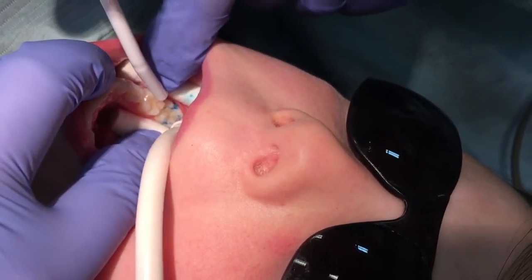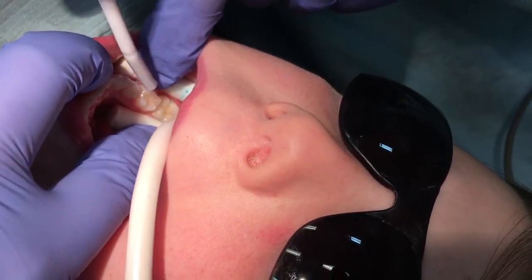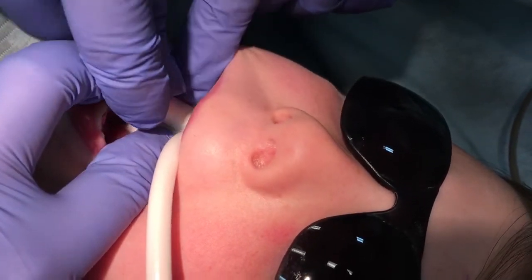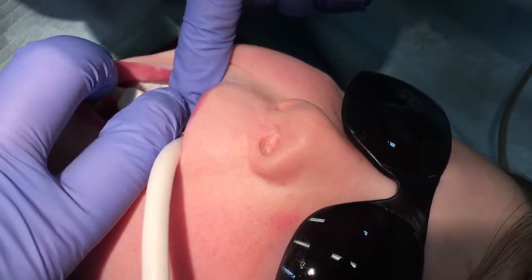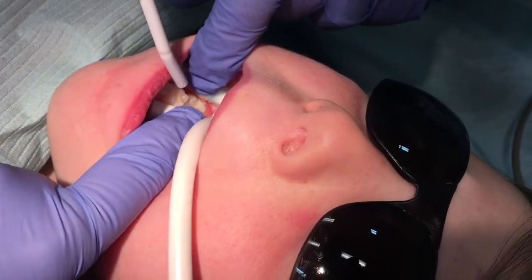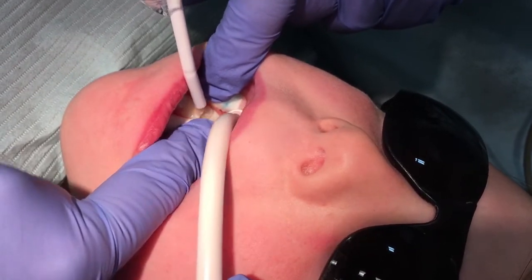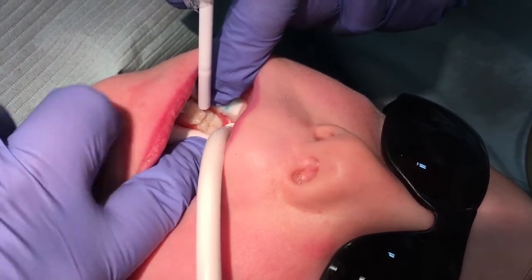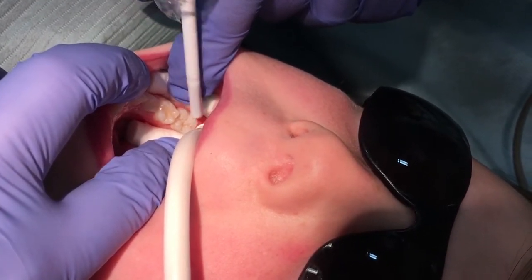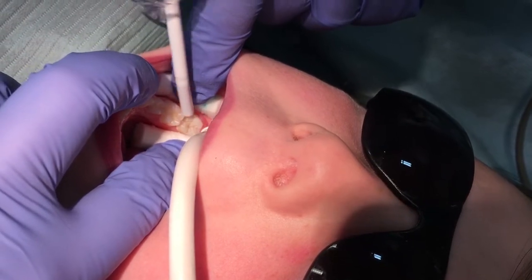Rinse off the etchant thoroughly. Remove excess water, then re-isolate. You can do this by either adding a cotton roll, if that's comfortable for your patient, or you can add a cotton roll and then use forceps to slip out the old, wet cotton roll from underneath. Do not allow saliva contamination when re-isolating. When the tooth is securely re-isolated, dry thoroughly. The surface should have a dull, frosty appearance.